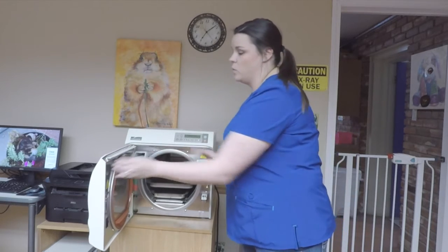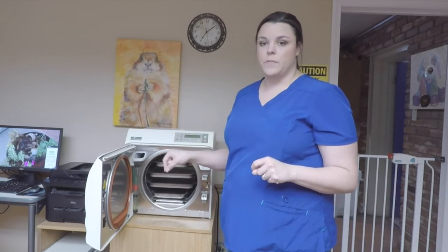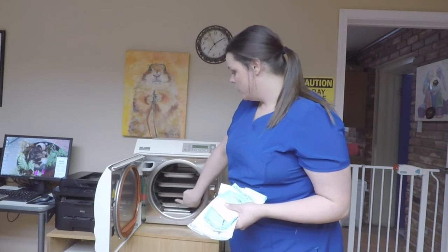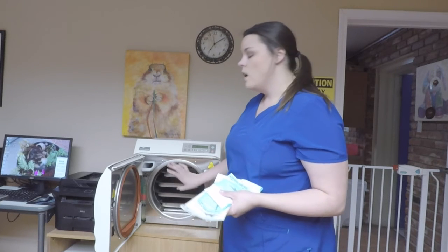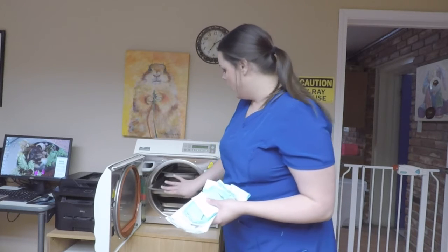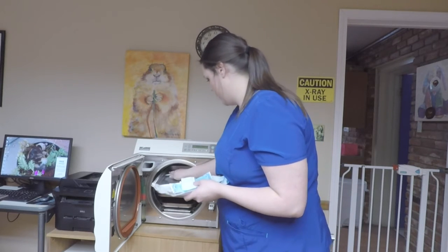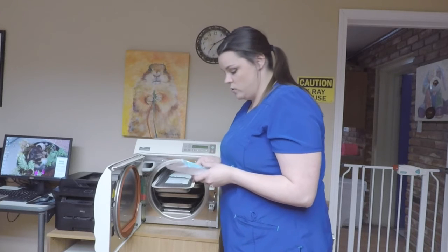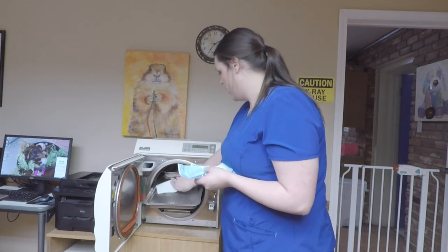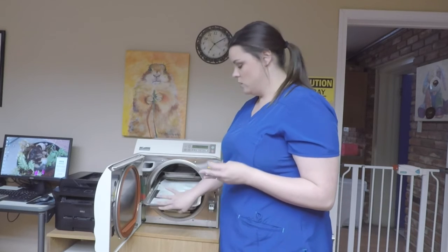And if you want, wait a few minutes to pull the surgical packs out of there because they are super hot. To pack an autoclave, we have 4 sets of trays here. The top one and the bottom one are the smaller trays, and then these fit our spay packs better. So when putting them in, you want to put everything face down, and then you do not want to overlap any of the instruments. That way it assures that the steam gets to every instrument.